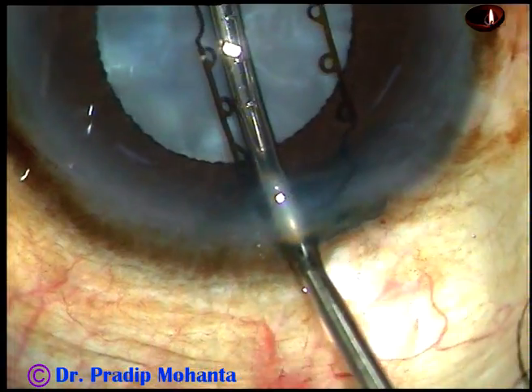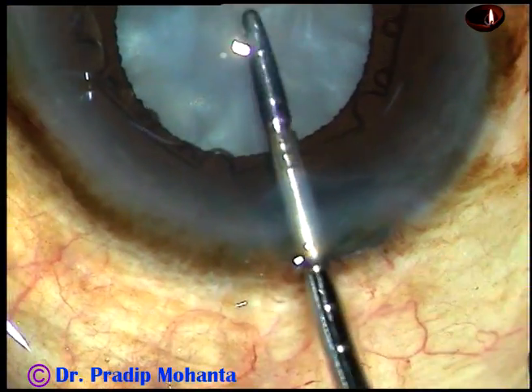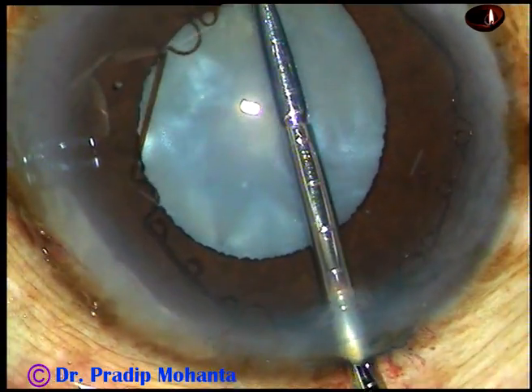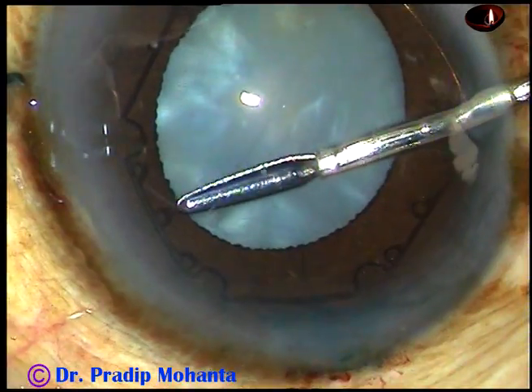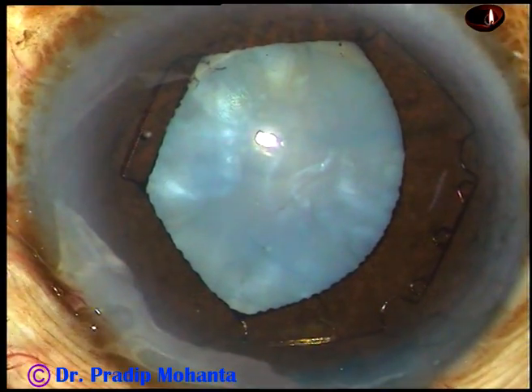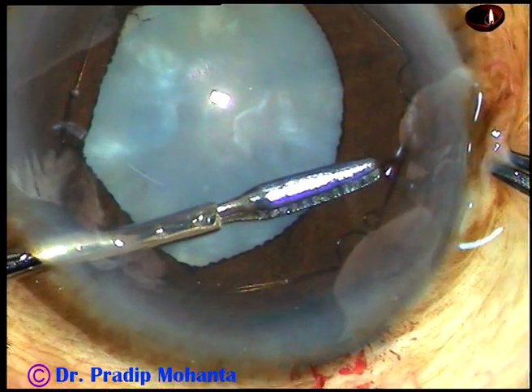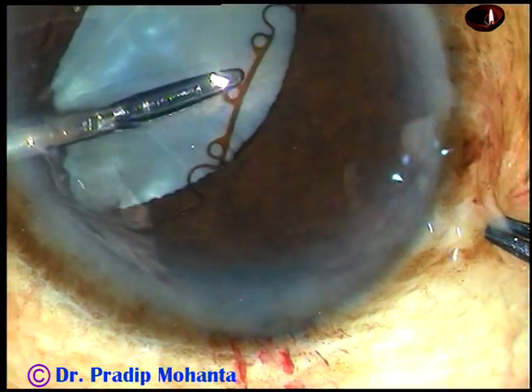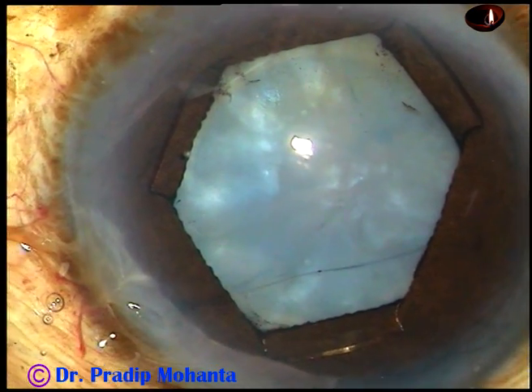This is introduced with B-hex forceps; the device should go completely into the anterior chamber. And now the leading flange is tucked underneath the iris. Now I go through the right side port and tuck the flange at 1:30 o'clock. Now I go through the left side port and tuck the flange at 10:30 o'clock. With B-hex forceps, these manipulations are not difficult.